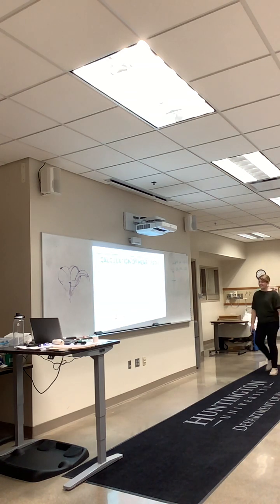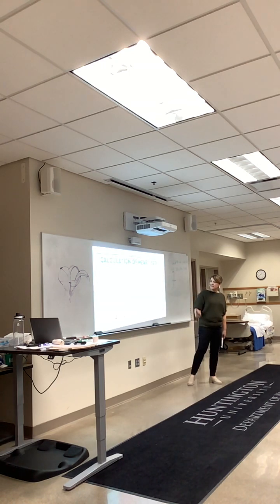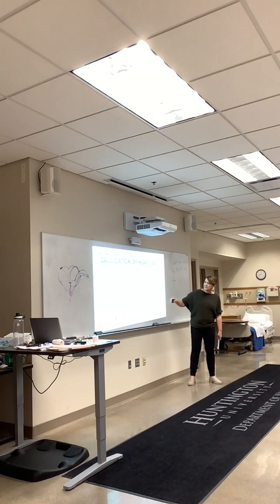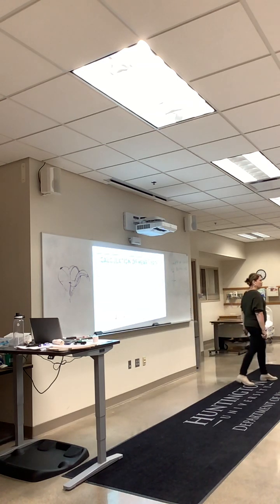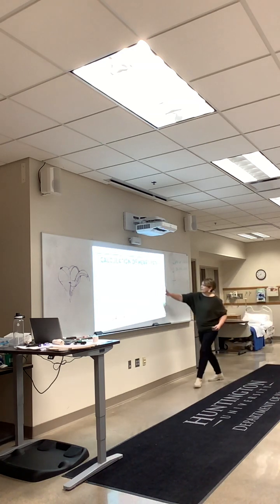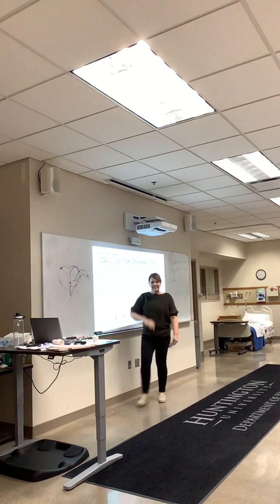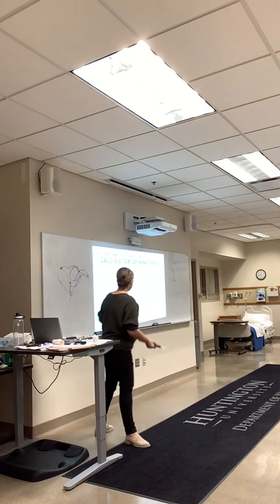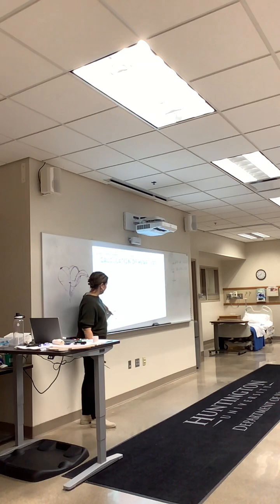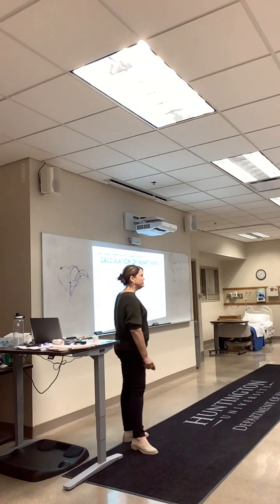Yes. All right, so what's this one? 14? That's 140. Is that what you guys said? I think I counted 1, 2, 3, 4, 5, 6, 7, 8, 9, 10, 11, 12, 13, 14. 140. This one? I would count for a full minute. First time around, 70.